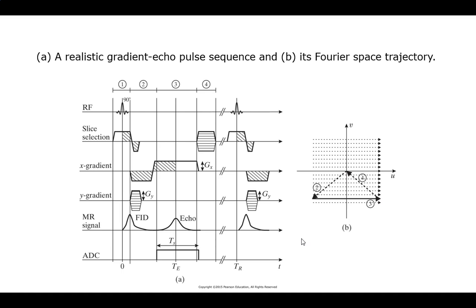And generally, I want to do this one fairly quick. So reasonably speaking, it actually will look more like that, but that's not as much of a problem. Again, you don't want any weird Y phasing oscillations. It just gives you a little more time for it to damp out.